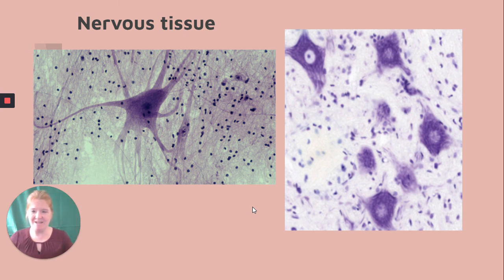Okay, so there you have it, a quick overview of how to interpret some histology slides.